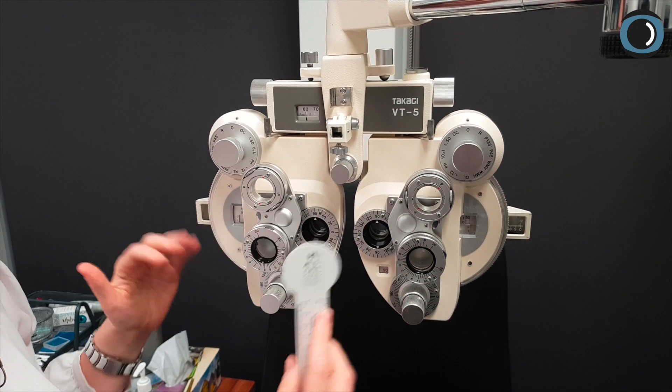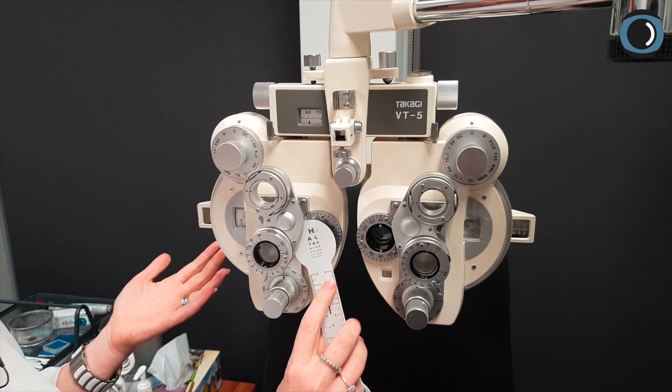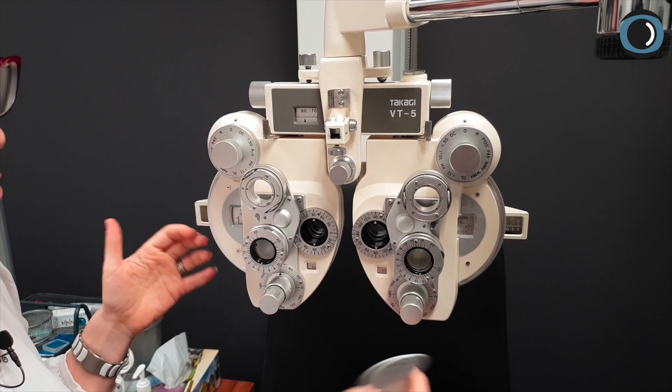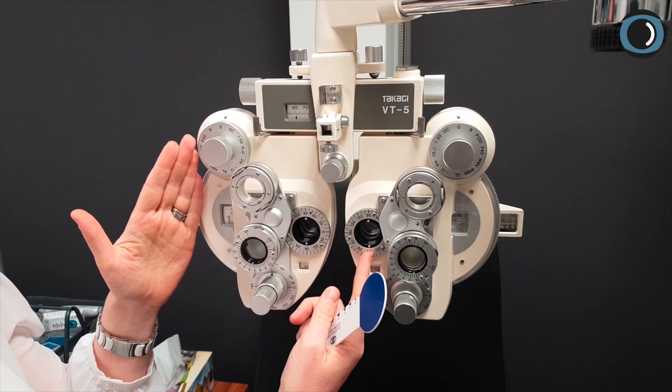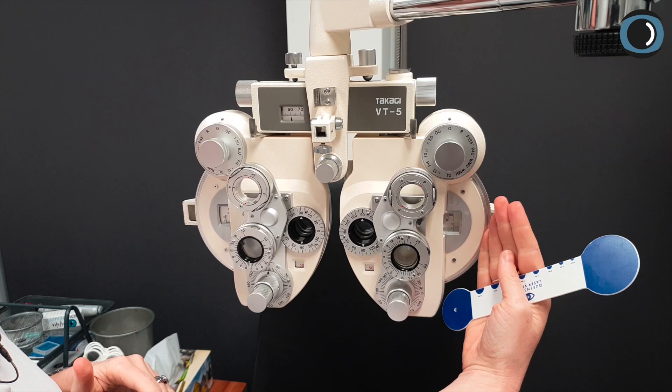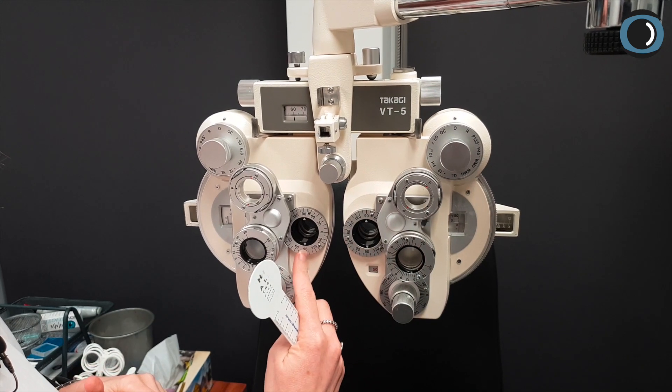You can now ask them which is clearer — right eye or left eye — but it doesn't actually matter at this point, because we know that when we added plus 0.25 to the right eye it made them prefer the left, and when we added plus 0.25 to the left it made them prefer the right.